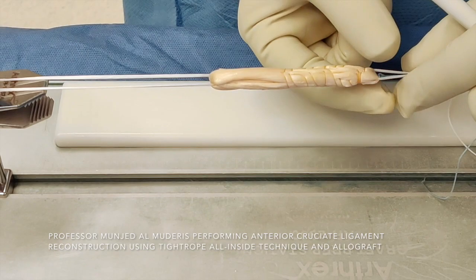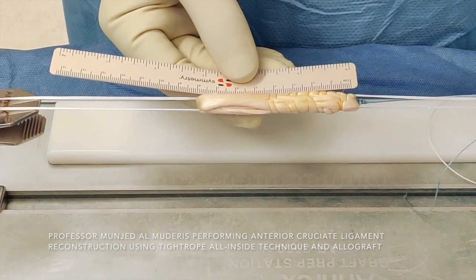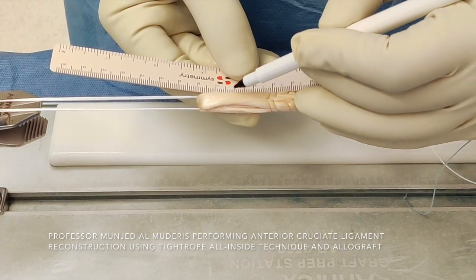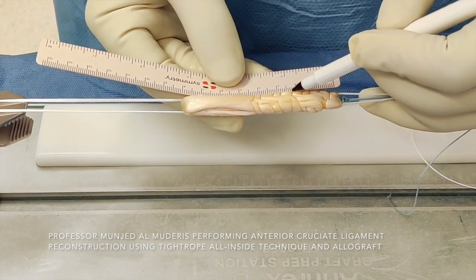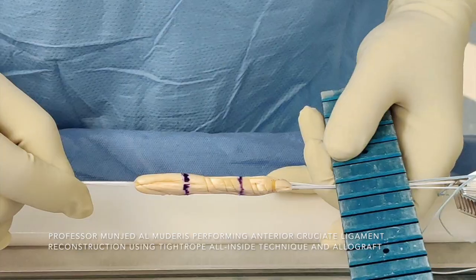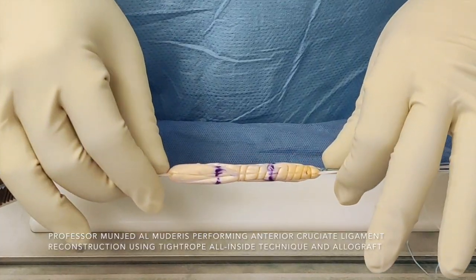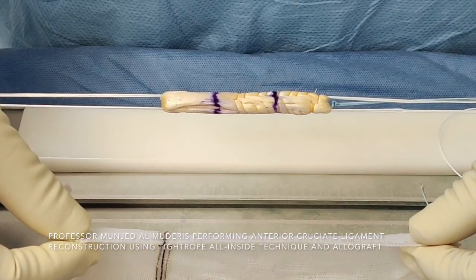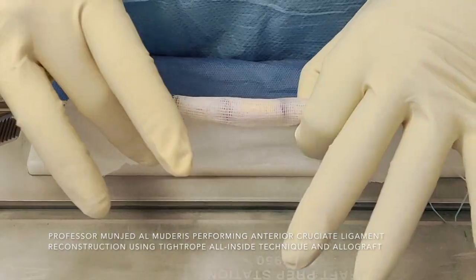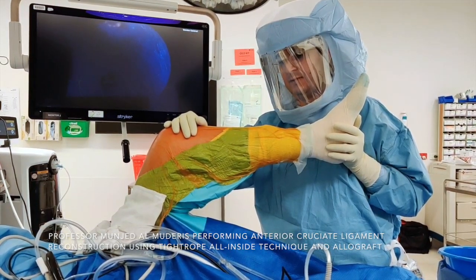This graft preparation technique involves covering the tendon completely without any abrasive suture showing. Only the monocryl is on view and it's very smooth. I mark the graft length — it's measuring 7.5 centimeters. I take into consideration the depth of my tunnel and measure two and a half from one end and two and a half from the other end. The graft size looks like around 10 millimeters, which is a very good size. We finish preparing the graft and leave it in antibiotic-impregnated saline. I then elevate and inflate the tourniquet.